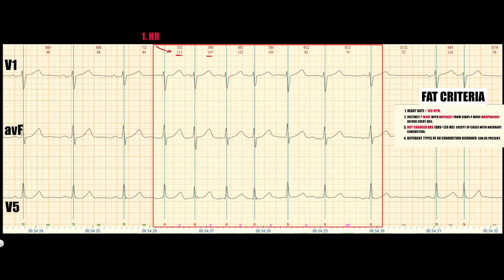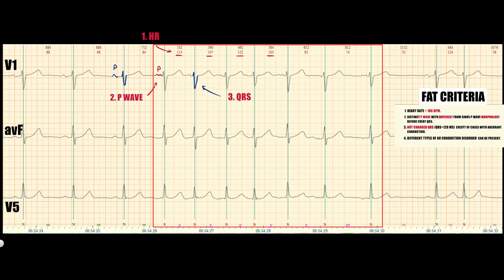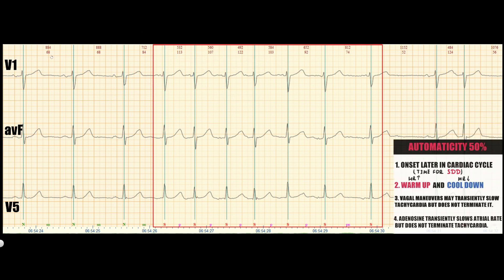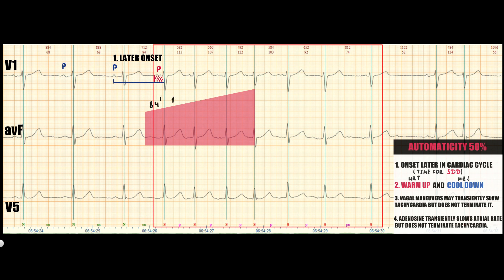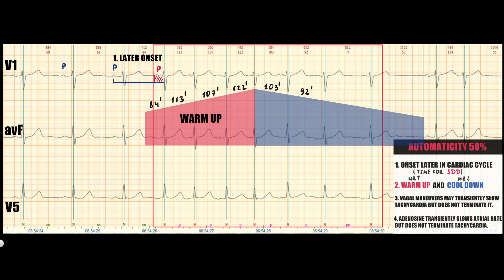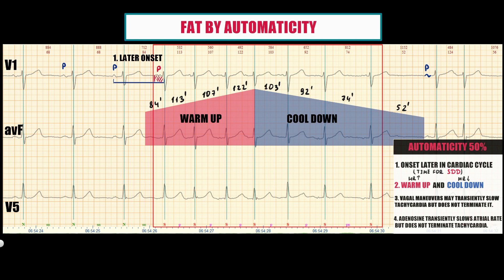In this example, heart rate is more than 100 beats per minute, indicating tachycardia. P-wave in V1 has a different morphology than the sinus P-wave. QRS complex has the same morphology as the sinus QRS. So all criteria of focal atrial tachycardia are present. The first complex of tachycardia occurs later in the cardiac cycle. At the beginning of tachycardia the heart rate increases — the warm-up period — and decreases before termination — the cool-down period. Both indicate automatic focal atrial tachycardia.